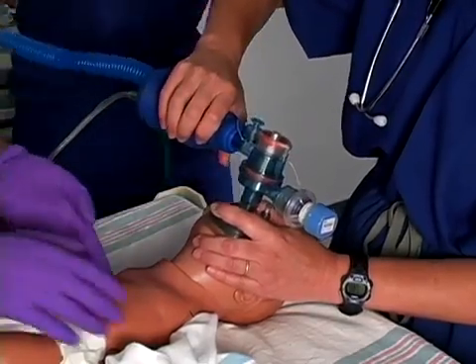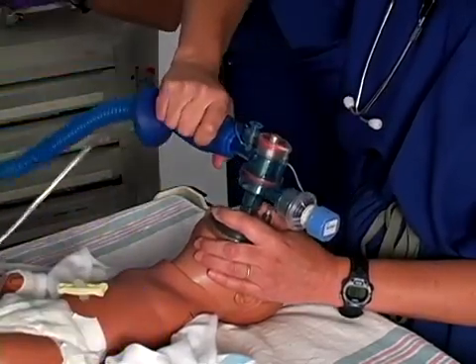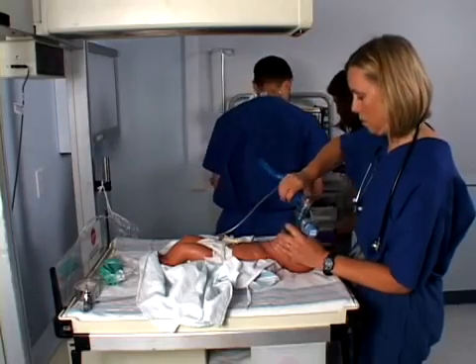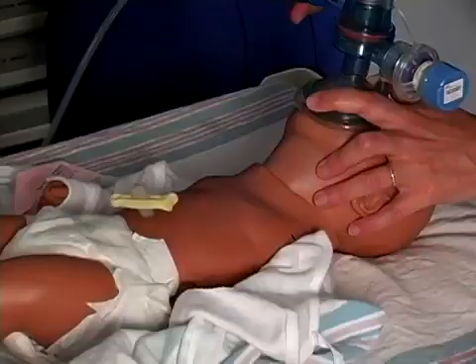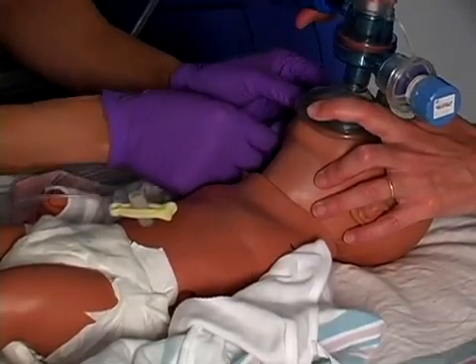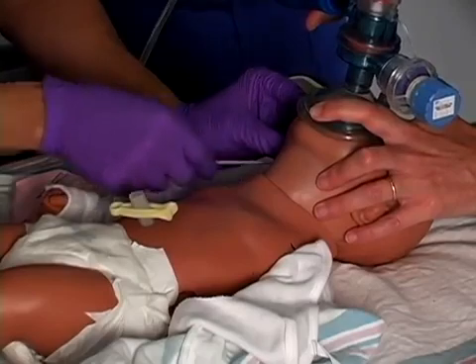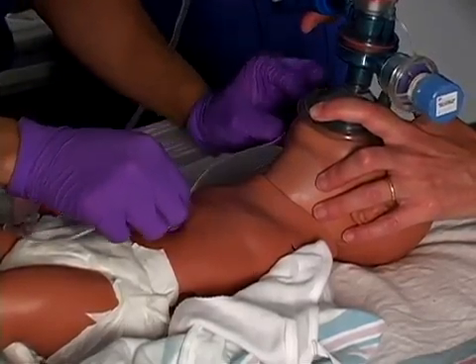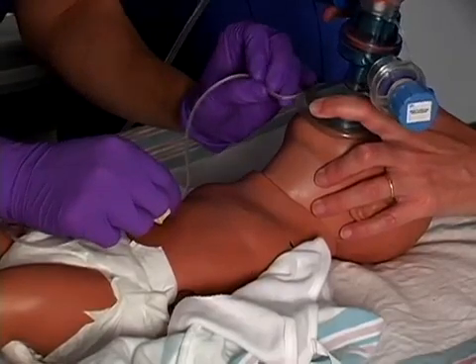I'm going to have to intubate, okay? Okay. I'll decompress the stomach with an OG. Insert an 8 French orogastric tube if a newborn requires positive pressure ventilation with a mask for longer than several minutes. Keep ventilating. I'm going to estimate the nasal bridge to the earlobe to halfway between the xiphoid process and the umbilicus. I'm going to place the OG tube.